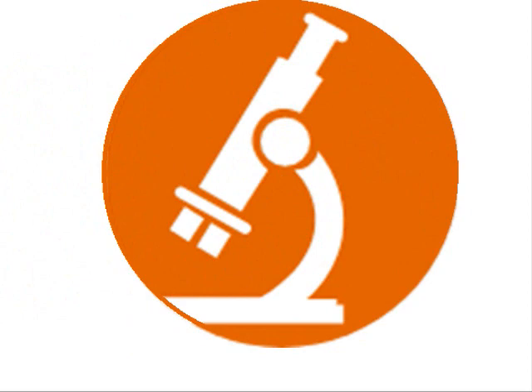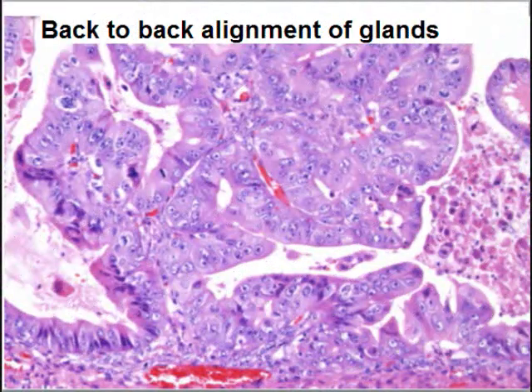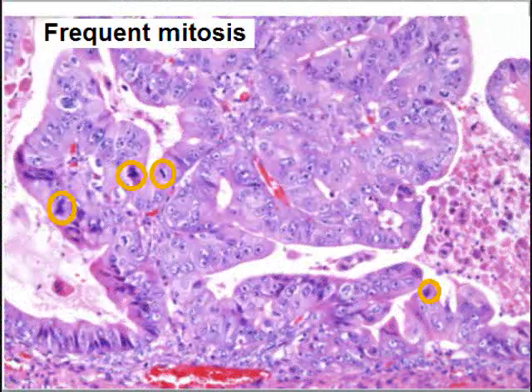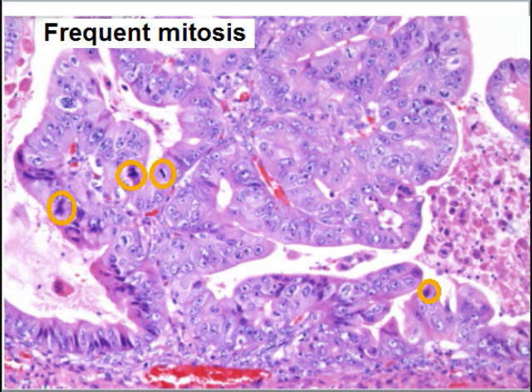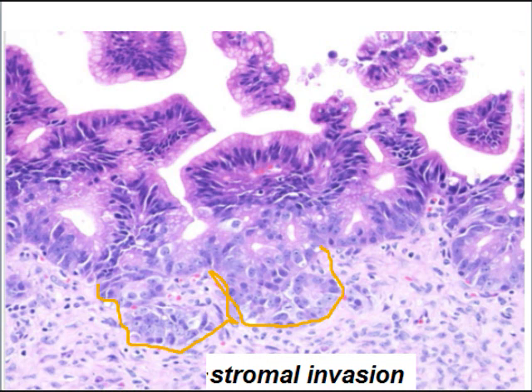When we observe the section under the microscope, there is a complex structure of malignant mucinous epithelium forming papillary formations. There is back-to-back alignment of glands with little stroma. There is stratification and multilayering of the mucinous epithelium. There are frequent and abnormal mitoses, and there is also invasion of the wall of the cyst — this is called stromal invasion.